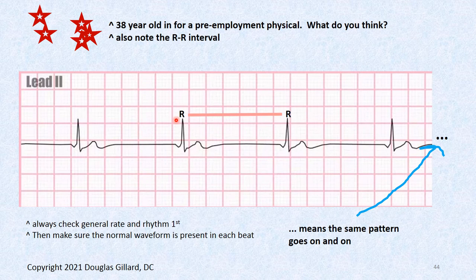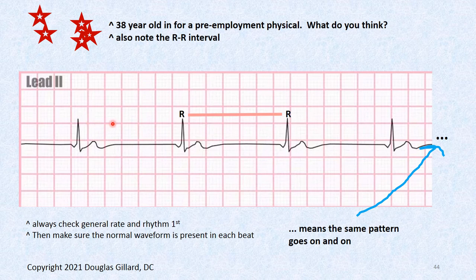Case: 38-year-old comes in for pre-employment physical, says he's in fantastic health. You run an EKG. Our intervals look good. Looking at the heart rate using the 300-150-100 rule: 300, 150, 100, 75, 60, 50 — the heart rate is about 50 beats per minute. The rhythm looks steady. Anything under 60 is bradycardia. Now looking at the waves: there's the T wave and QRS complex. Where's the P wave?